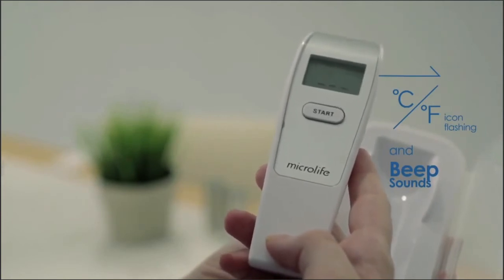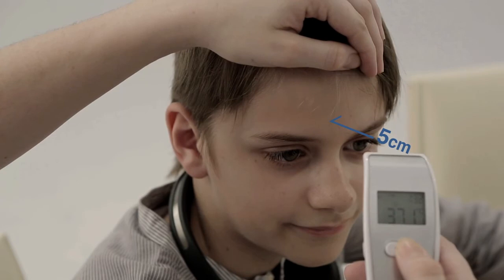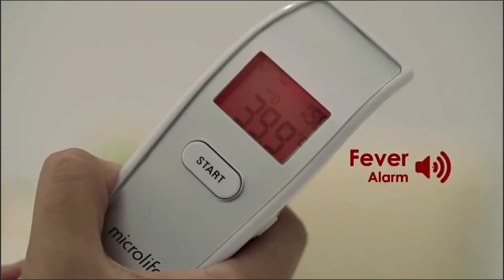Aim the thermometer at the center of the forehead with a distance of no more than 5 centimeters. Ten short beeps and a red LCD backlight alert the patient that they may have a temperature equal to or higher than 37.5 degrees Celsius.